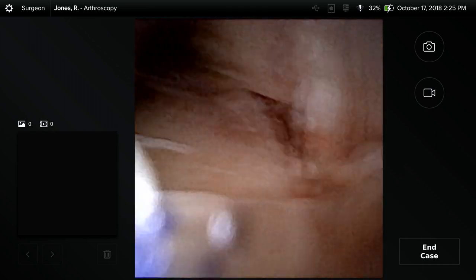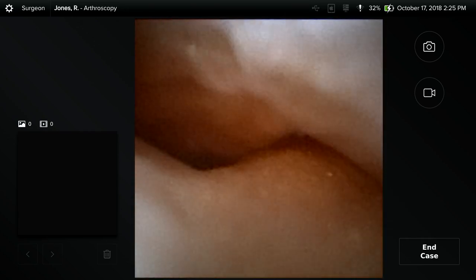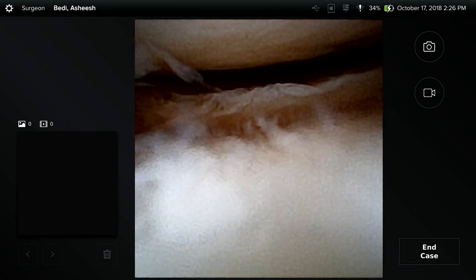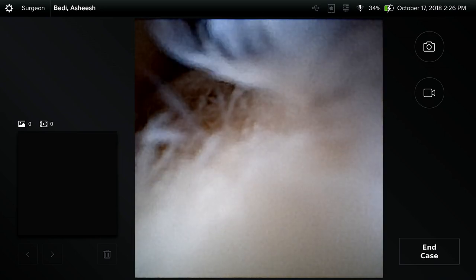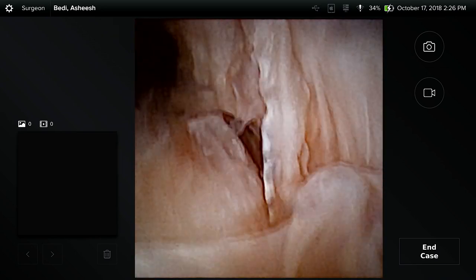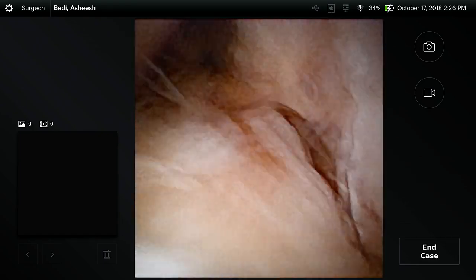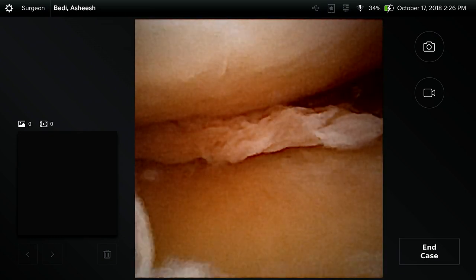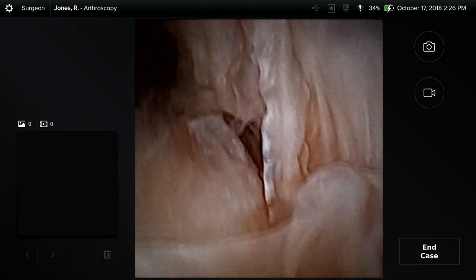There's the lateral compartment of the knee joint. As we walk around the ACL towards the medial compartment, without applying any valgus to the knee joint whatsoever, we're already able to see a reasonable amount of the medial compartment. And then past the ACL without any varus we can drive all the way to the back of the knee and access the entire lateral compartment. The nanoscope is a zero degree scope but it gives you a fairly panoramic 120 degree field of view.